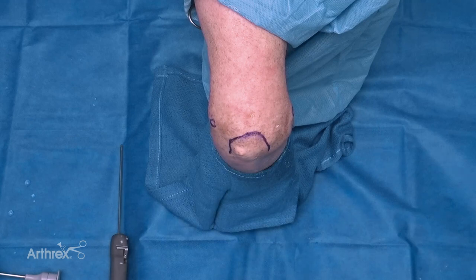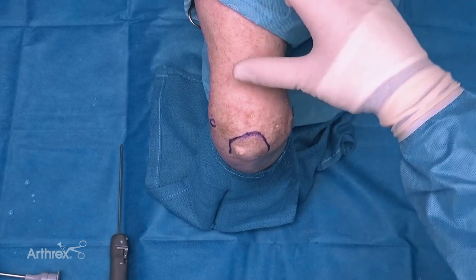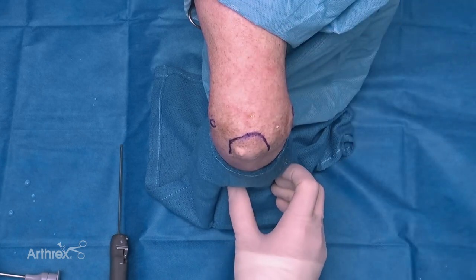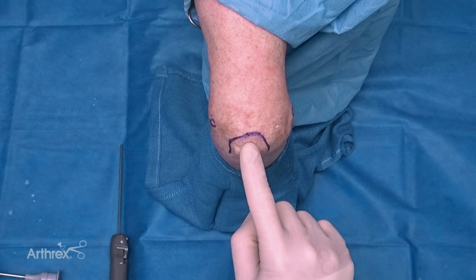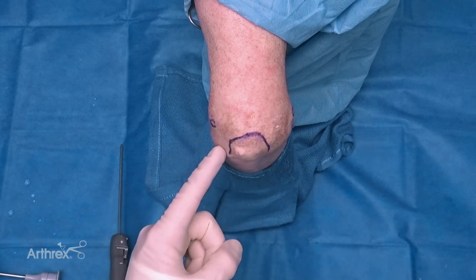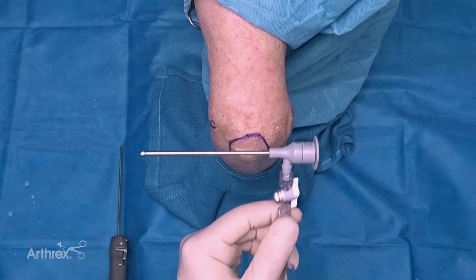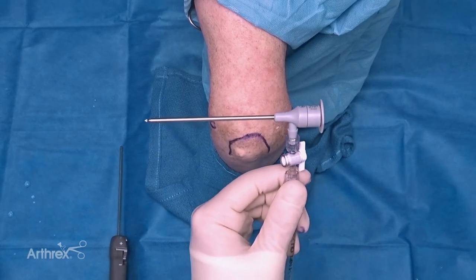We're going to show you the nanoscope for elbow arthroscopy. To get you oriented, we have a patient in the lateral decubitus position. This is a right elbow - the humerus is here, the shoulder would be up higher, and the forearm is hanging down. I've marked out the olecranon, this is the medial epicondyle, so obviously the ulnar nerve is here, and here's our lateral epicondyle.